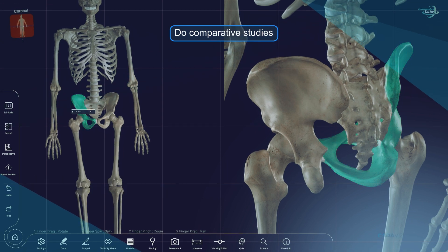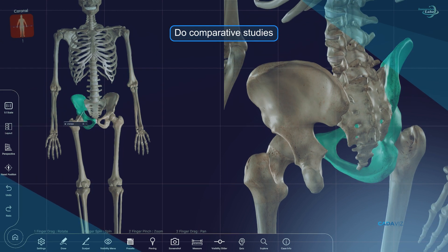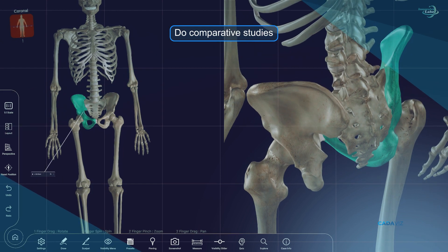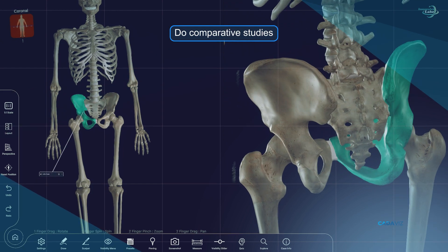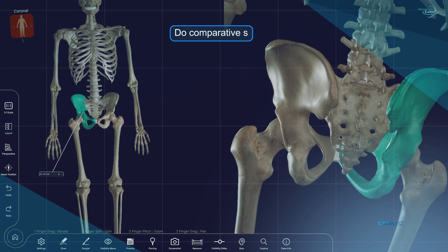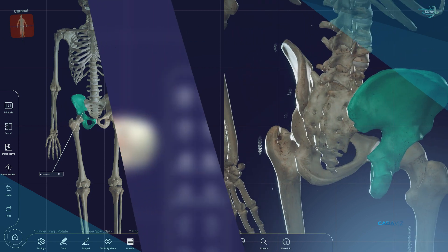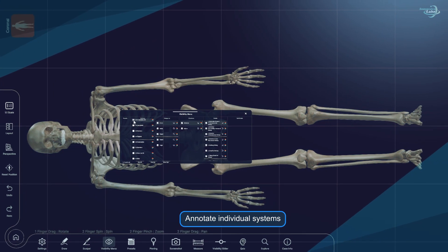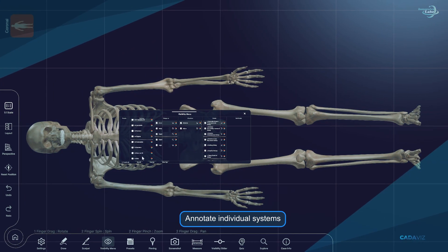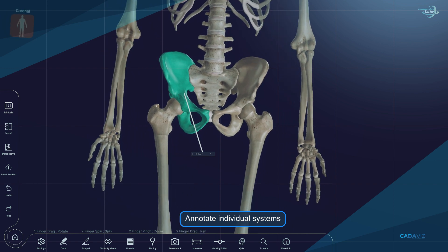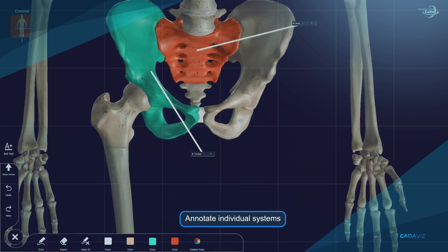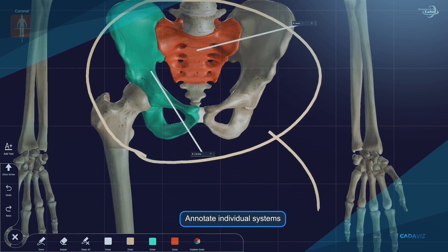There are multiple split screens to do comparative studies. A visibility menu allows you to show, hide, and annotate individual systems, categories, structure or details, and many more.